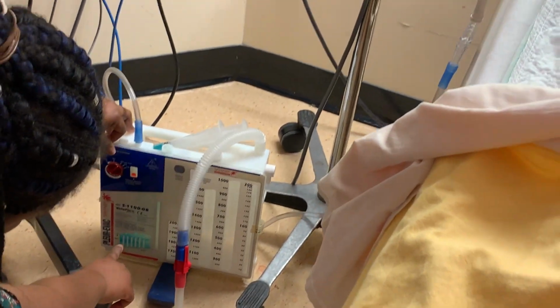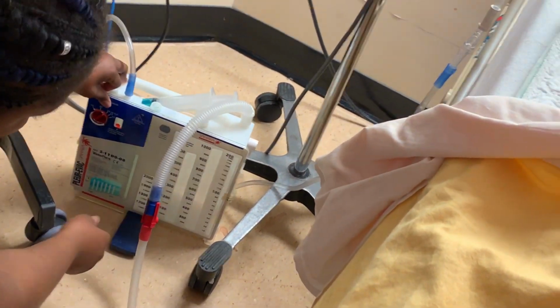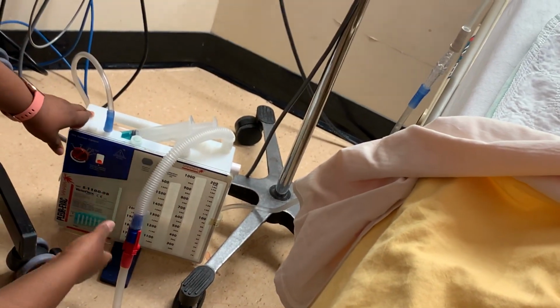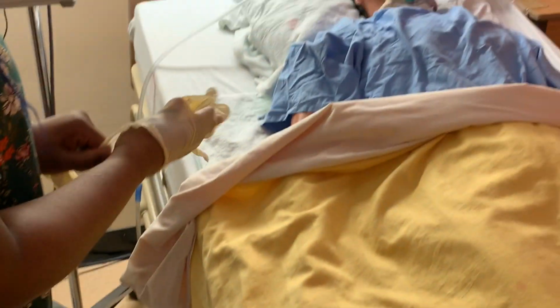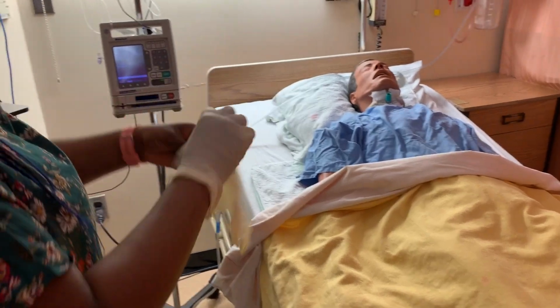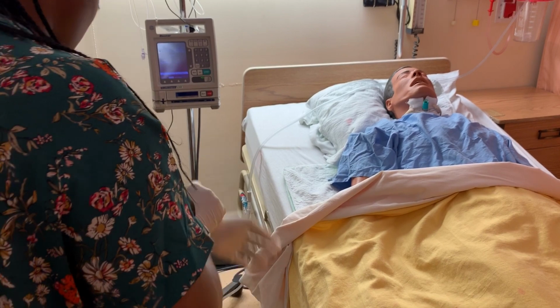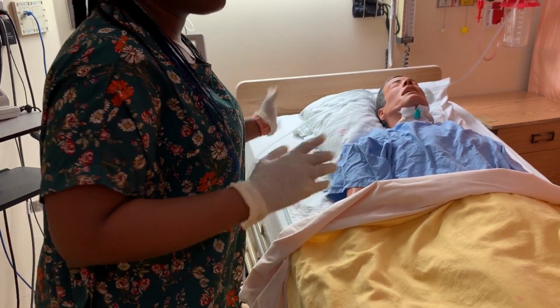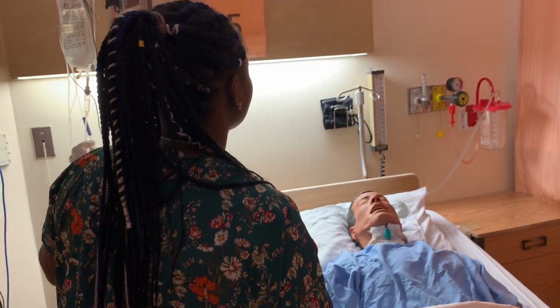So looking at my air leak chamber, this is meant to be normal, a little bit of bubbling is not a problem, but this is vigorous bubbling, which means there's air in my patient. So first of all, I'm gonna put gloves on. I also have to have my sterile dressing, but for the sake of this video, I'm not gonna do anything. So I'm gonna get my clamping forceps.